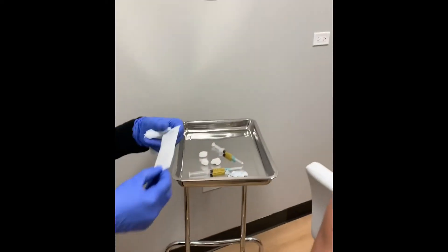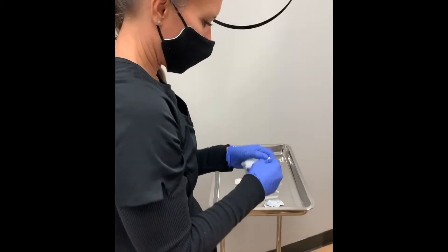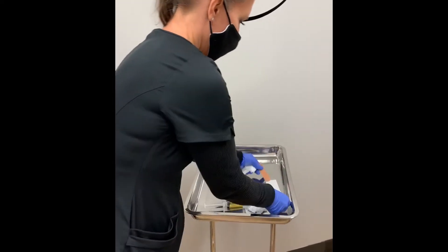Have you taken any damage to the shoulder over the years? Yeah, I was a hockey player for most of my life and then I got into bodybuilding, so I've had a lot of injuries. So this is going to help you repair and regenerate the ligaments, the tendons, the muscles, the nerves — all those kinds of things. We just took your blood, spun it down, and taken the good stuff out of it, which we like to call liquid gold.